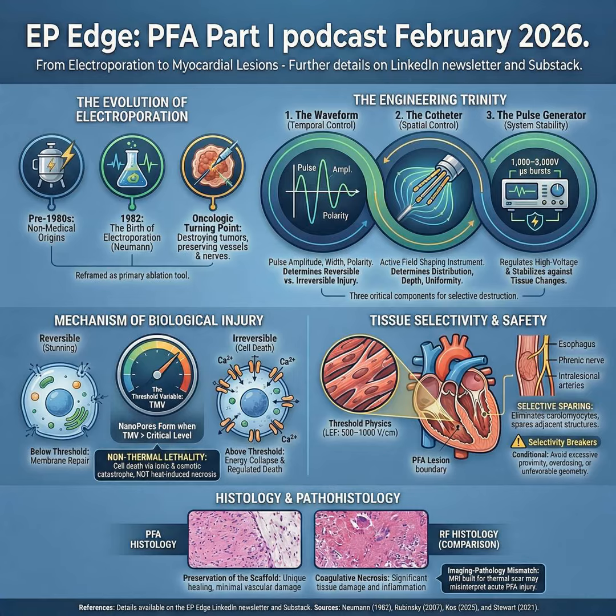The term electroporation itself came from that biophysics world, the idea that electrical energy can cause pore formation in a membrane. So even before cardiology adopted it, the central principles were already established: membrane targeting, threshold behavior, and the importance of electric field distribution over energy dose in the thermal sense.